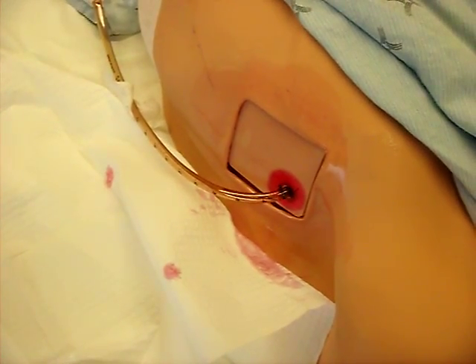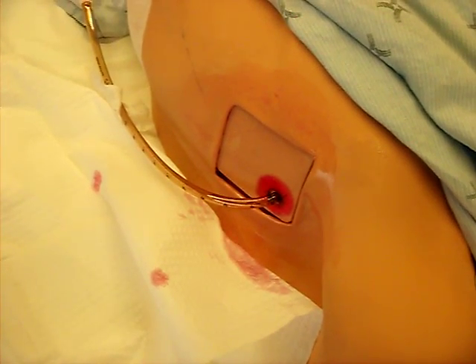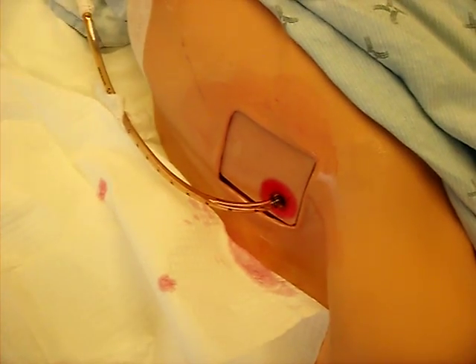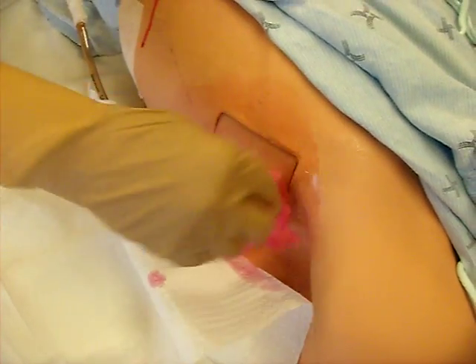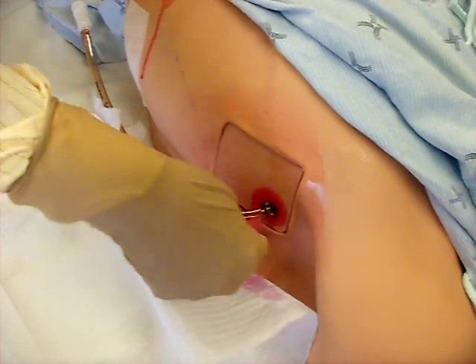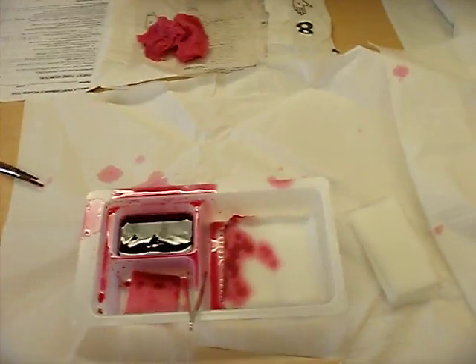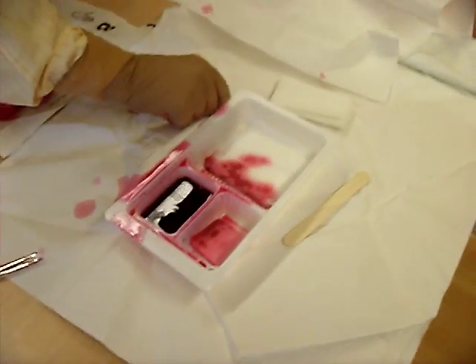There's no absolute here, as long as you're being thorough and you're getting a good soaked gauze for the patient. So again, if you want to use your own hands, you can do that, but you want to make sure that, of course, you're not contaminating yourself and so on. So once the tube is cleaned, this is an opportunity to let the chlorhexidine gluconate dry, and this is where you can have the conversation again with your patient.